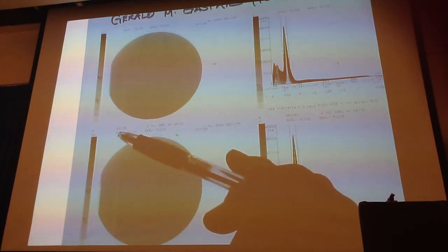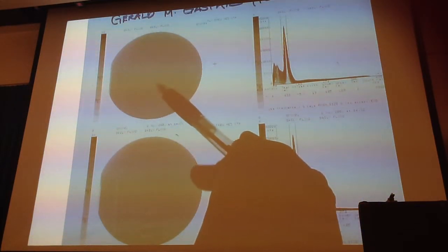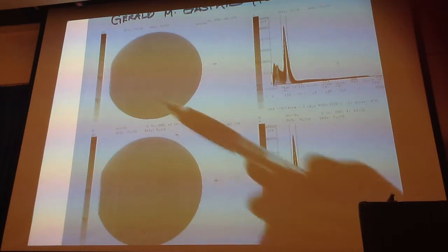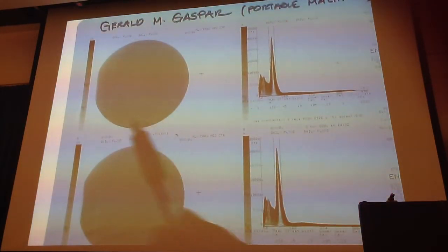You don't want to do 3 months worth of patients and then find out every day you had something like this going on. Every one of those images should be repeated if that happens. So on that one, which amplifier is acting up? It's the X gain.